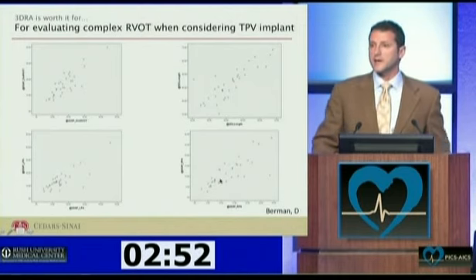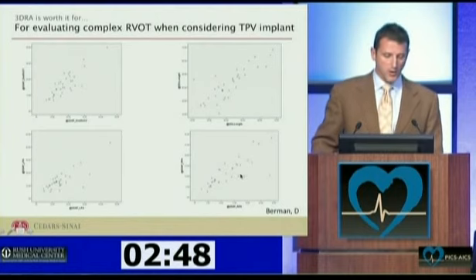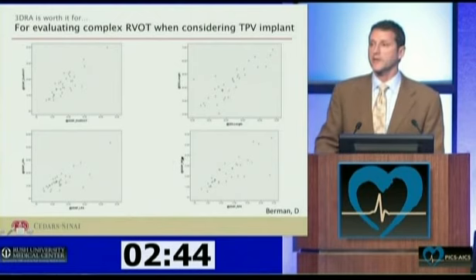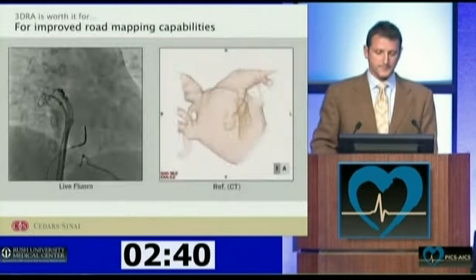It turns out that at least in this relatively small sampling, the R value for things like the RPA diameter and LPA diameter were not nearly as scattered and bad as we thought they would be. So we'll see where that leads us.